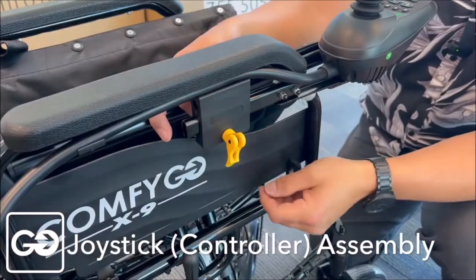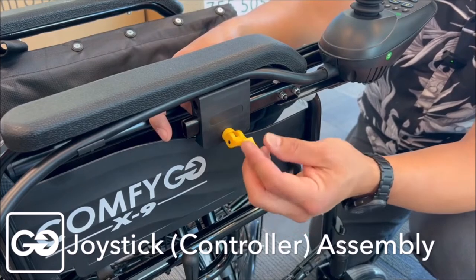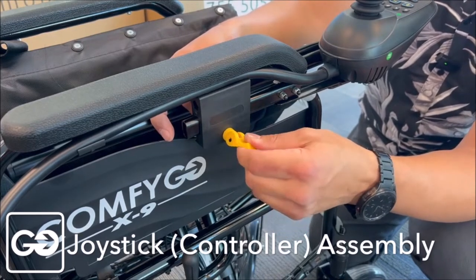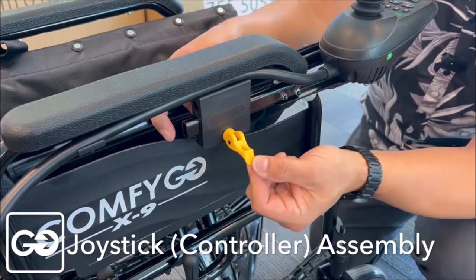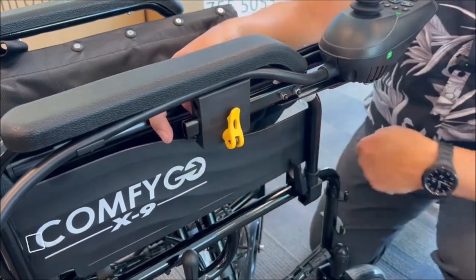When you receive your X9, this camera system that locks your joystick in place will be fairly loose, as you can tell. What we're going to do is give it one or two turns clockwise — turn it clockwise once around to tighten it up. It should be snug about halfway through, and then we push this up to lock your joystick in place.